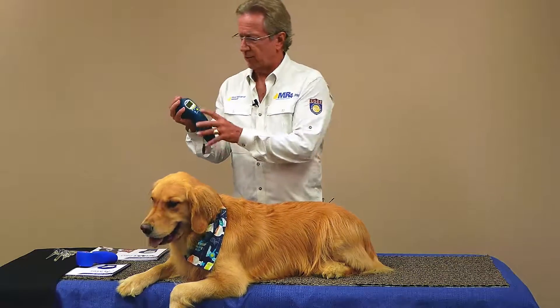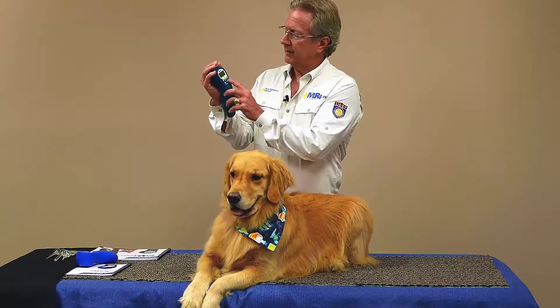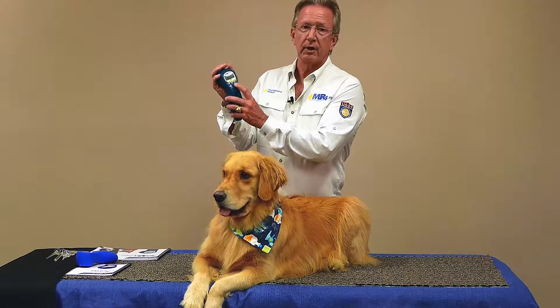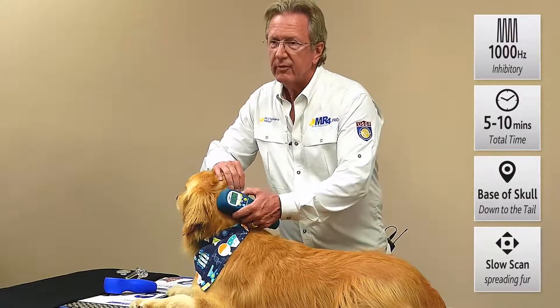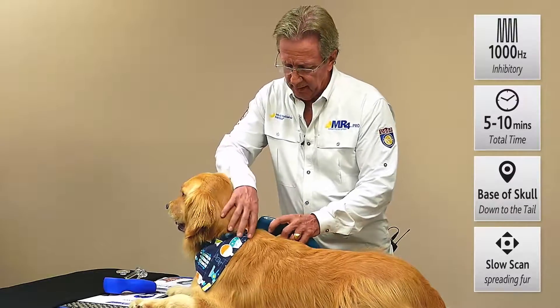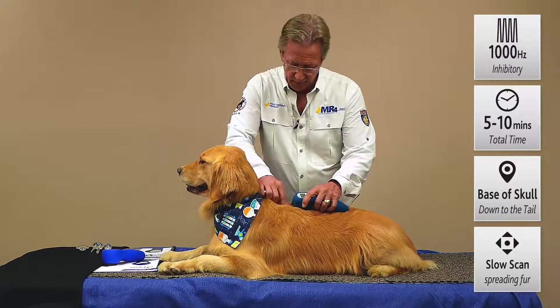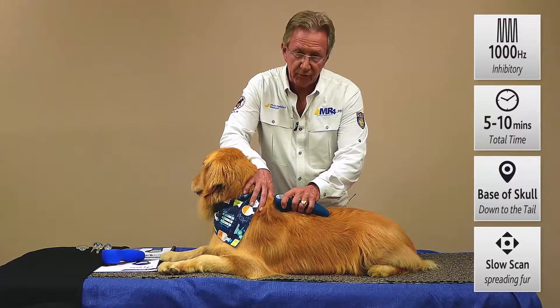1000 Hertz is your go-to for pain, so we just scroll right over to 1000 Hertz, press select, and then select our time. In this case we'll scroll over to five minutes and we're good to go — just push the power button and you've now started. You can see the visible red, but along with the visible red at 640 nanometers is the 875 broadband infrared and the 905 nanometer super pulse laser. We'll just spread her fur as we go down to get that emitter closer to the skin.